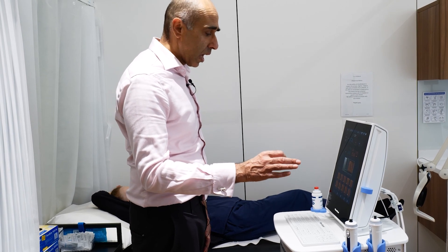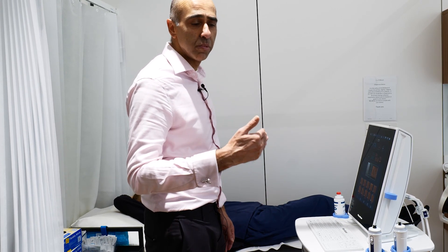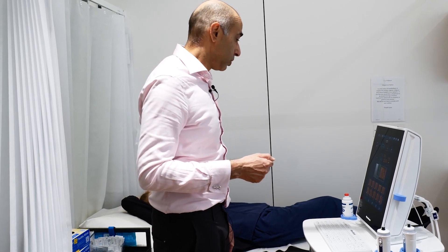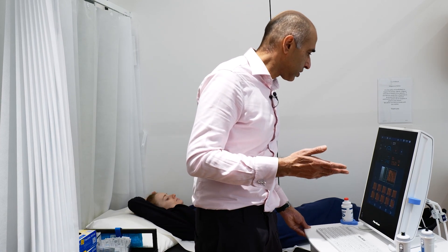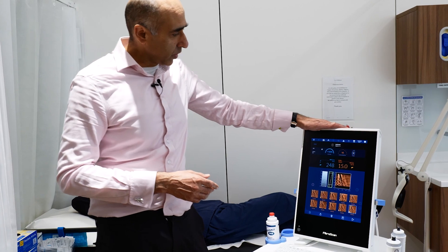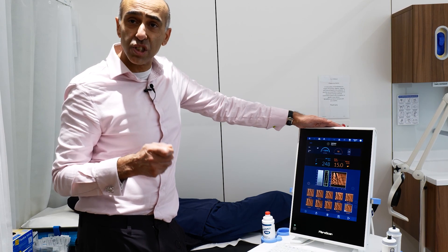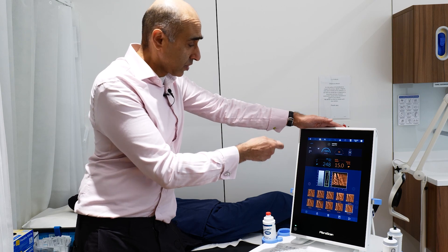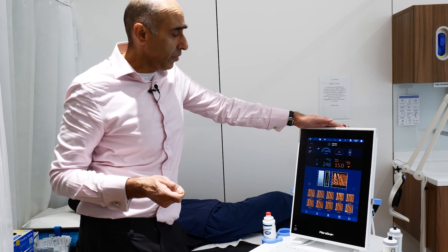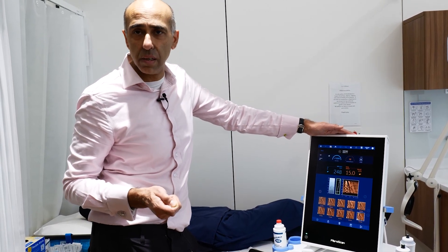There are two probes — one medium and one large. The large probe is very useful when we need to get measurements deeper inside the liver, which we do in some patients. At the end of the test, we'll have results. The key numbers to look at are the orange one, which tells us about stiffness or scarring of the liver, and the blue one on the left, which tells us about the degree of fat in the liver. We can then give the patient an answer as to how much scarring and how much fat there is.